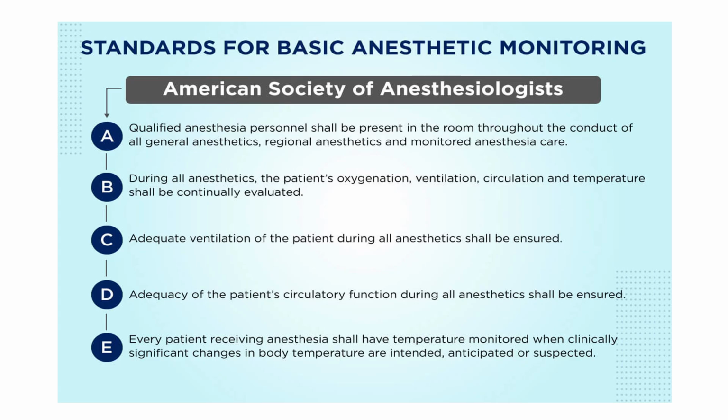Let's talk about the standards for basic anesthetic monitoring, set by the ASA, the American Society of Anesthesiologists. The most important, standard number one, is qualified anesthesia personnel.